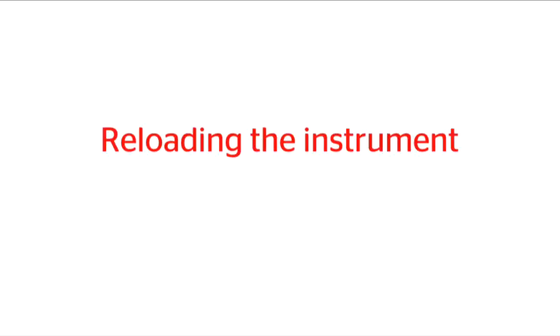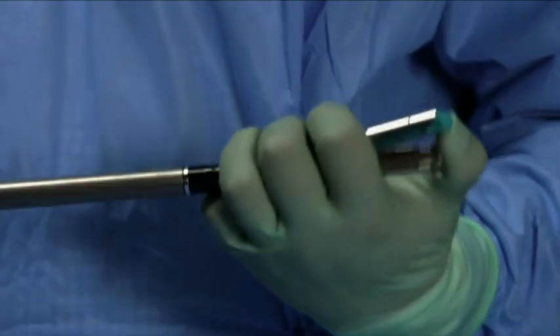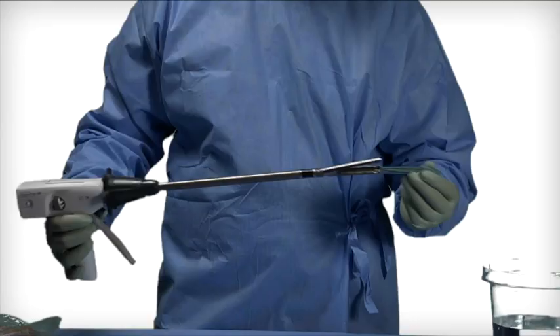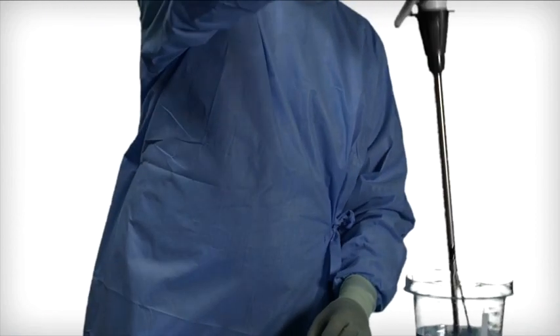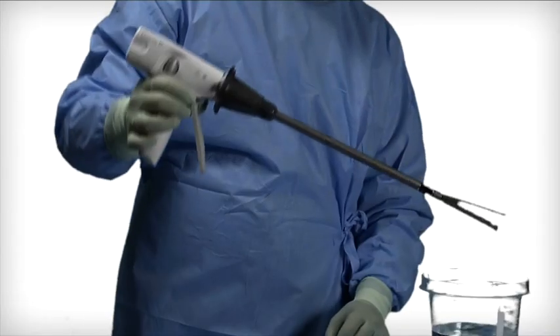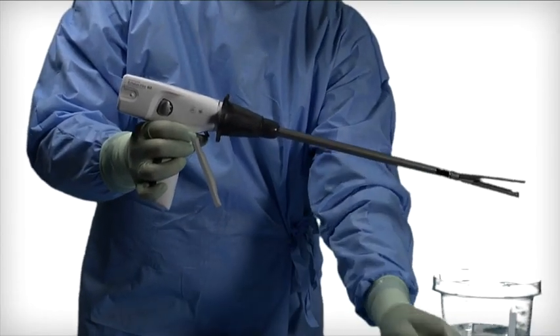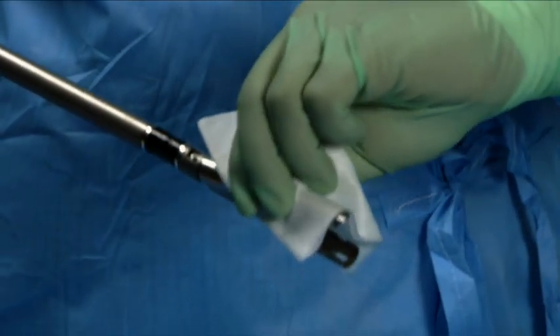Reloading the instrument. Push the reload upward using the pad of the thumb to unsnap the reload from the reload jaw. With the instrument in a vertical position and the anvil and reload jaw completely submerged in sterile solution, swish the jaws vigorously. Then wipe the inside and outside surfaces to clean any unused staples from the instrument. The device is ready to reload.